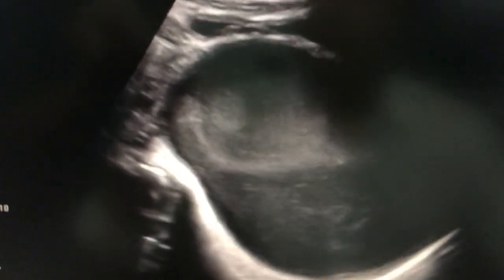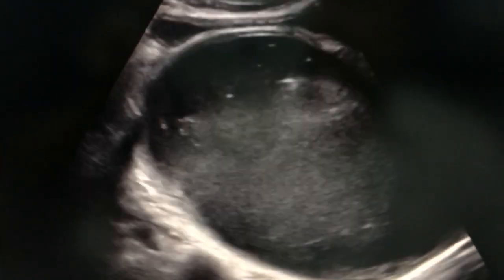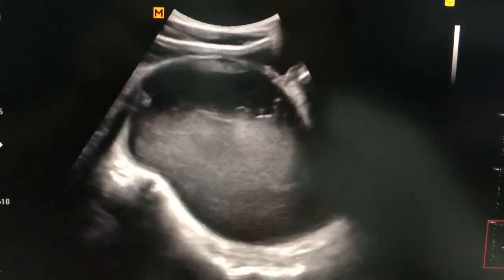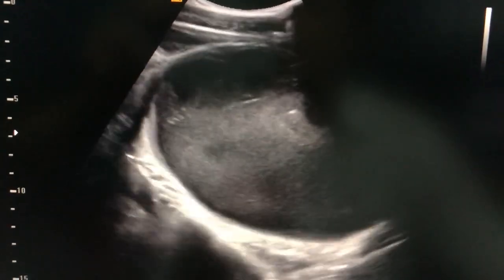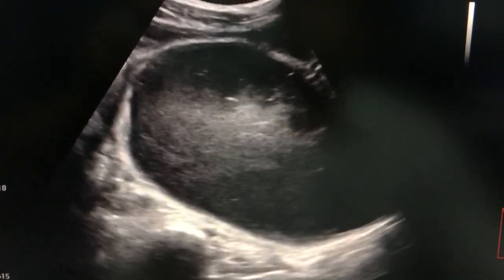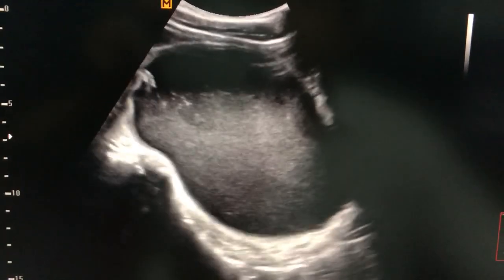We had turned the patient to be in prone position, and see now, once again the patient is in supine position after being in prone position, and here all this debris which is present in the cystic area, the ovarian cyst, it is moving.